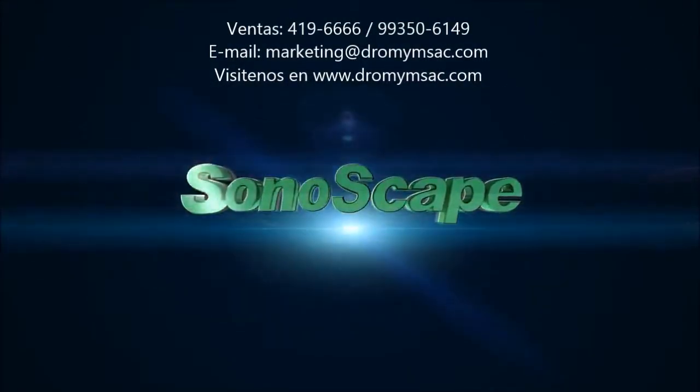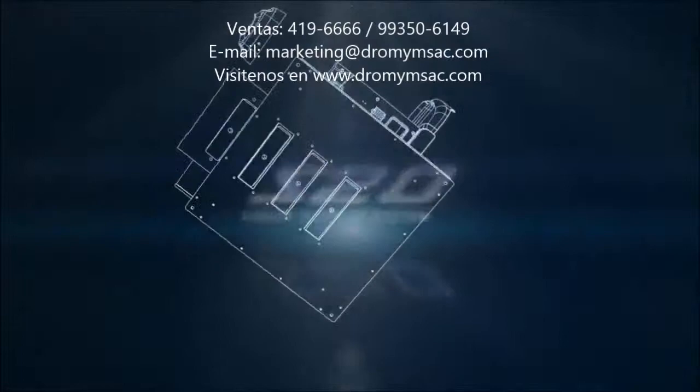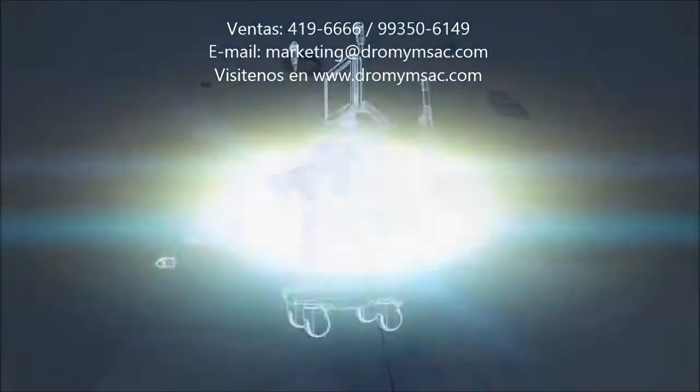2011, a new offer from Sonoscape. S20, the next generation color Doppler system. Touching your needs with optimum solutions.